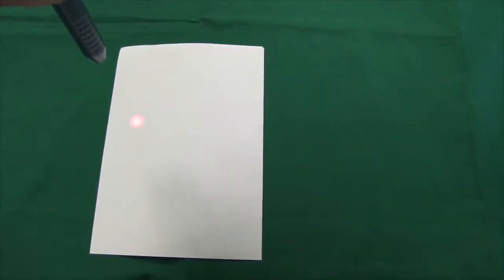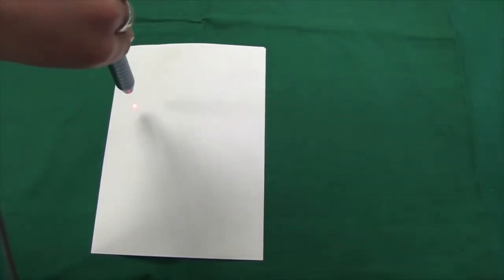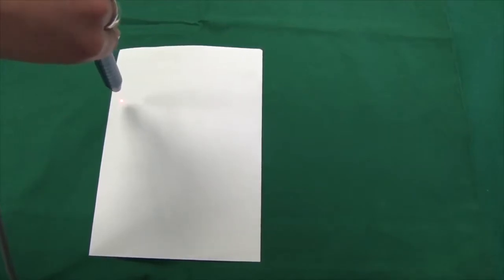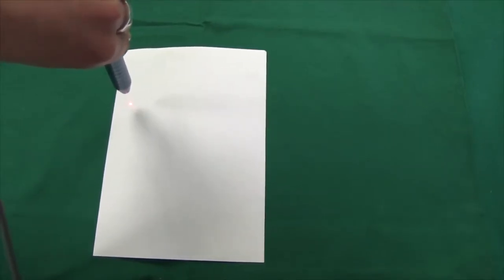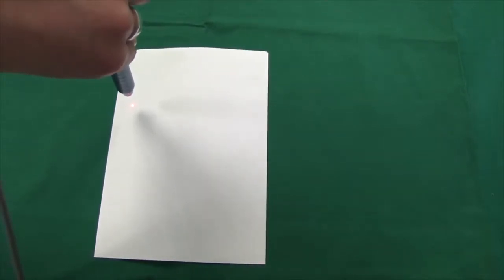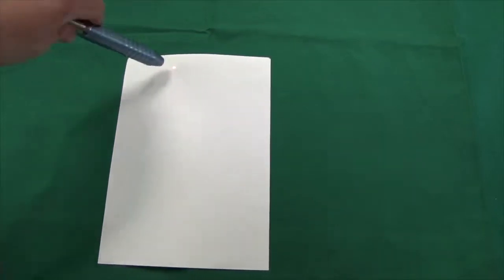The supply cable fiber needs to be exchanged if brightness is low or the light is not evenly distributed. Diffused light and unclean or frayed spot beams may also be an indicator for a damage or contamination inside the focusing handpiece or the supply fiber.